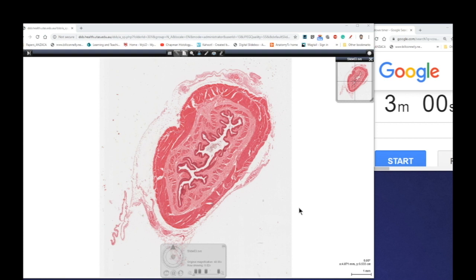G'day everyone, Jamie Chapman here for another episode of 3 Minute Histology. In this video we're going to be continuing our look at epithelial tissue, and in particular this video is going to focus on stratified squamous non-keratinized epithelium. Stratified means it's multiple layers thick. Squamous means the surface cells near the lumen are flattened like scales. Non-keratinized means the cells have not undergone cell death and we find nuclei all the way to the surface.